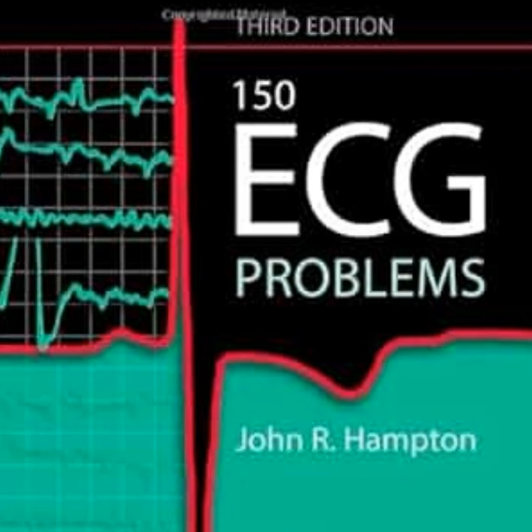So hyperkalemia, which is elevated serum potassium, classically presents with tall, peaked, and narrow T waves. But hypokalemia, low potassium, manifests with T wave inversion, ST depression, and these really prominent U waves. But why does potassium specifically target the repolarization phase of the ECG? Like, what is actually happening at the ion channel level to physically change the shape of that wave on the paper? Okay, for that, it requires looking at phase 3 of the cardiac action potential. Okay, take us back to physiology.